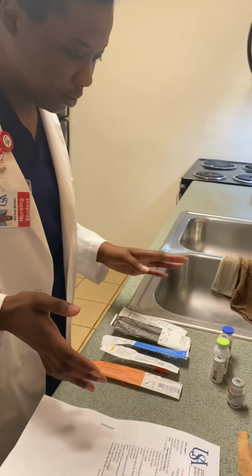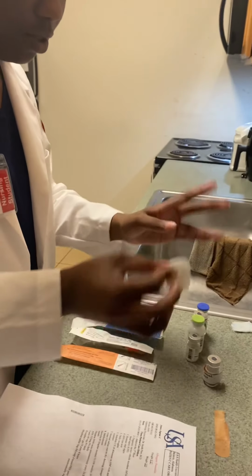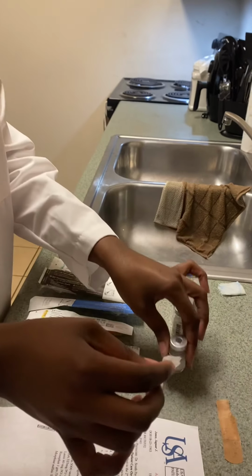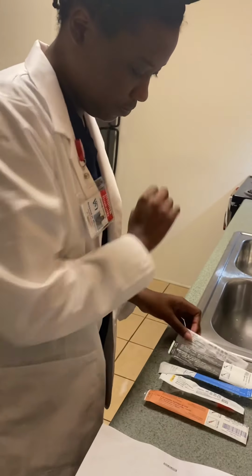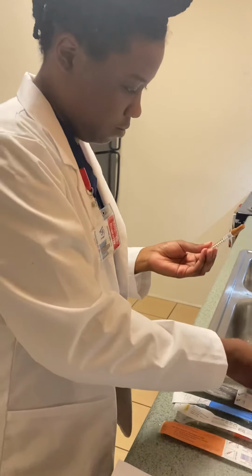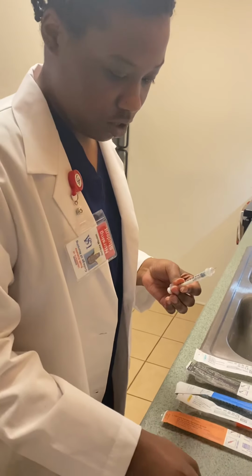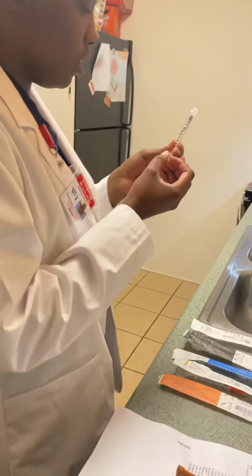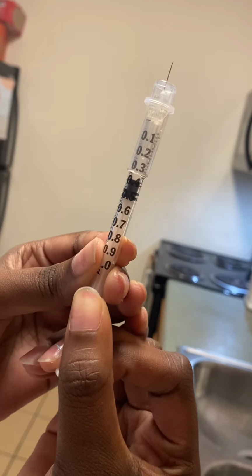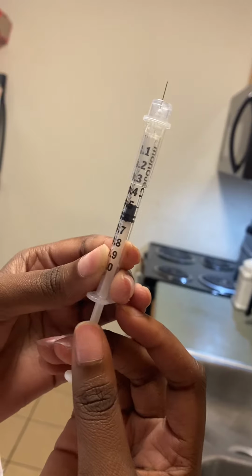So first thing I'm going to do is, I don't have any alcohol pads, so this is going to be my alcohol pad. And I'm going to wipe off my vial, and I'm going to throw that in the trash. And I'm going to use the tuberculin safety syringe. So first thing is I'm going to uncap it, and I'm going to get 0.5 milliliters of air. So there we have it, 0.5.